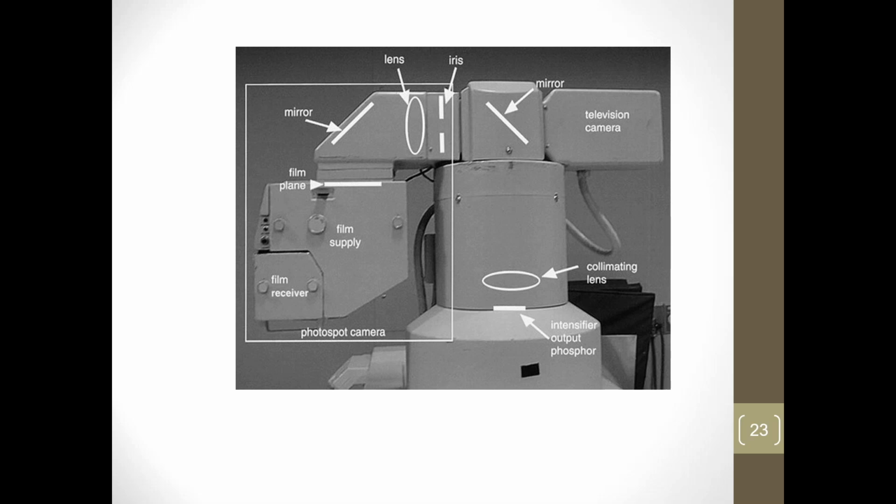More or less, they could get about one run worth of film on each one. And then they would have to change the film out, put in a new spool of film, and then process the old film. They probably could get, I don't know, 20, 30 images before the film ran out. And then they'd have to stop and reload everything and then keep going.